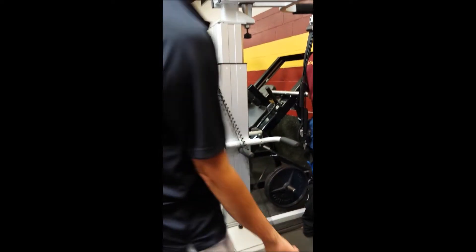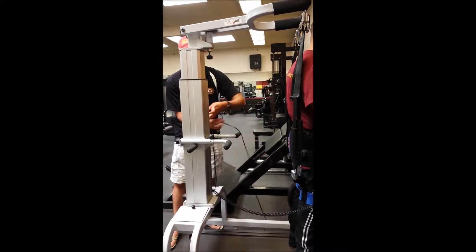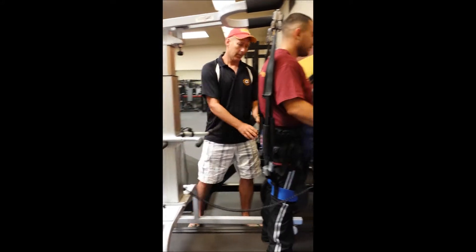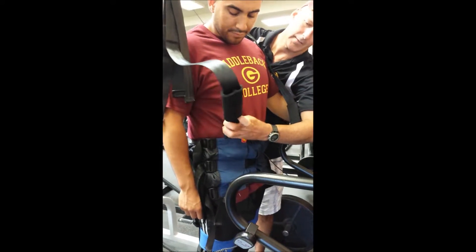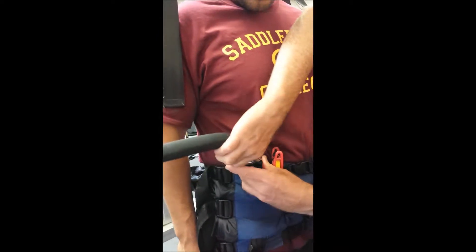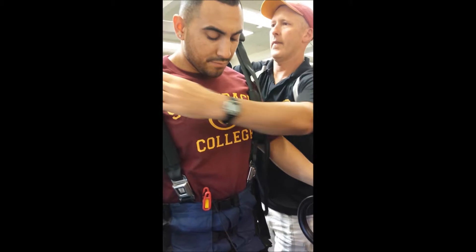There are a lot of cords here. I'm going to bring this up because Tim will be trained to make adjustments — to increase or decrease the height. I'm going to lock these clips in around the backside, same thing around the front side. Tim's traumatic brain injury has affected his right side more than his left, so similar to tightening bolts, I'm going to tighten his right — his affected side — first until snug, then tighten his left side snug.